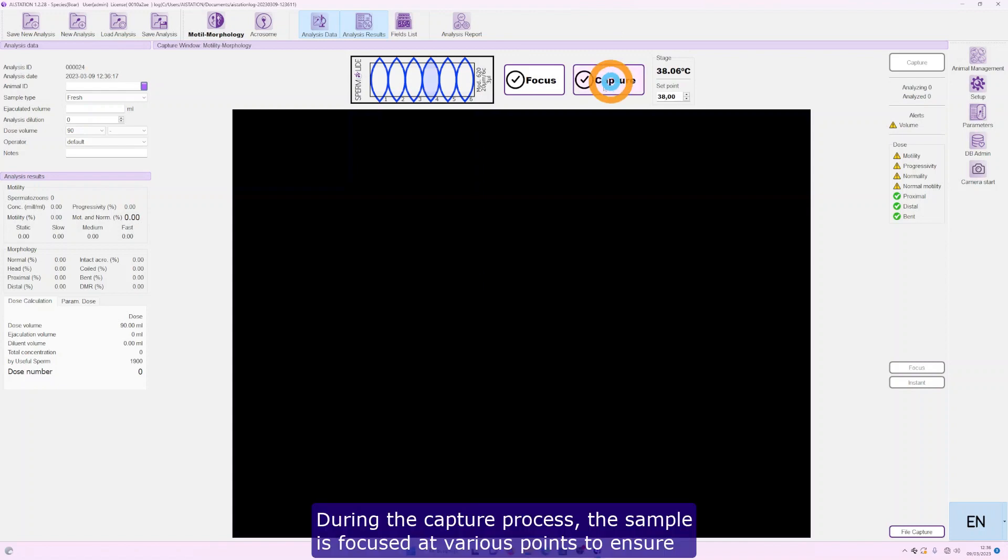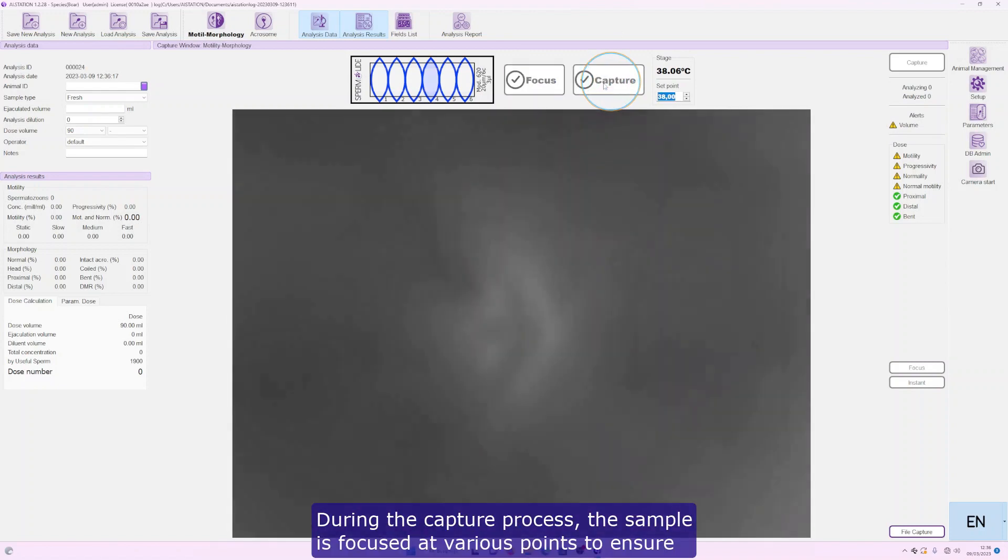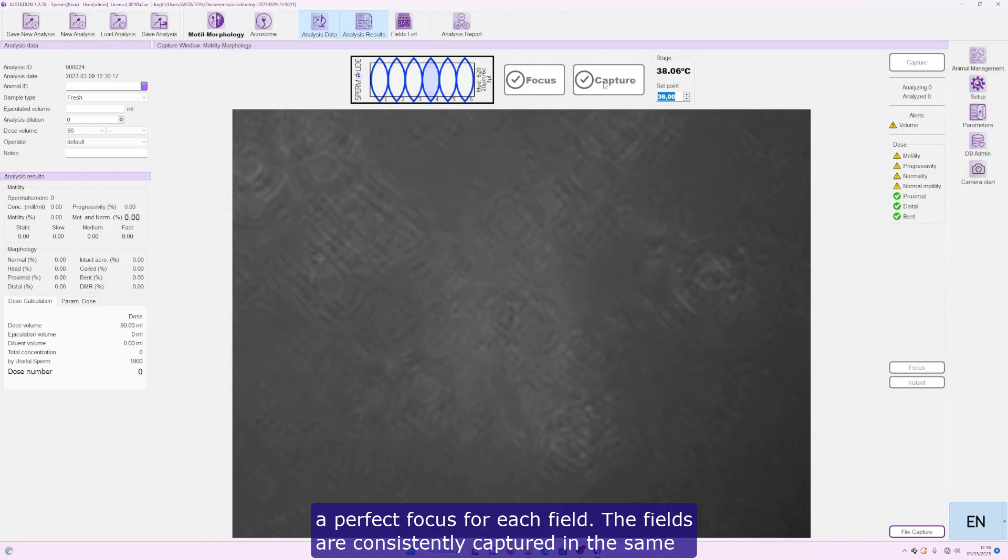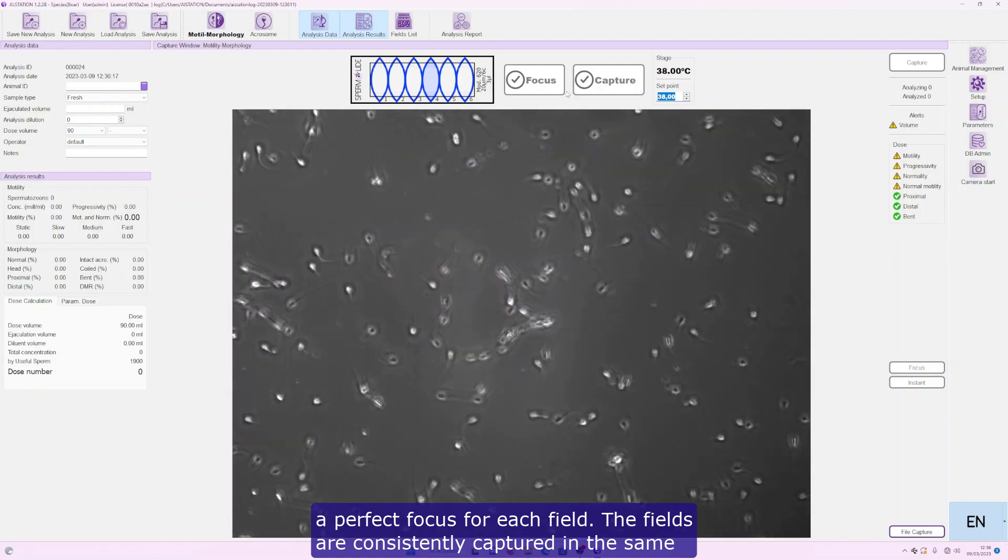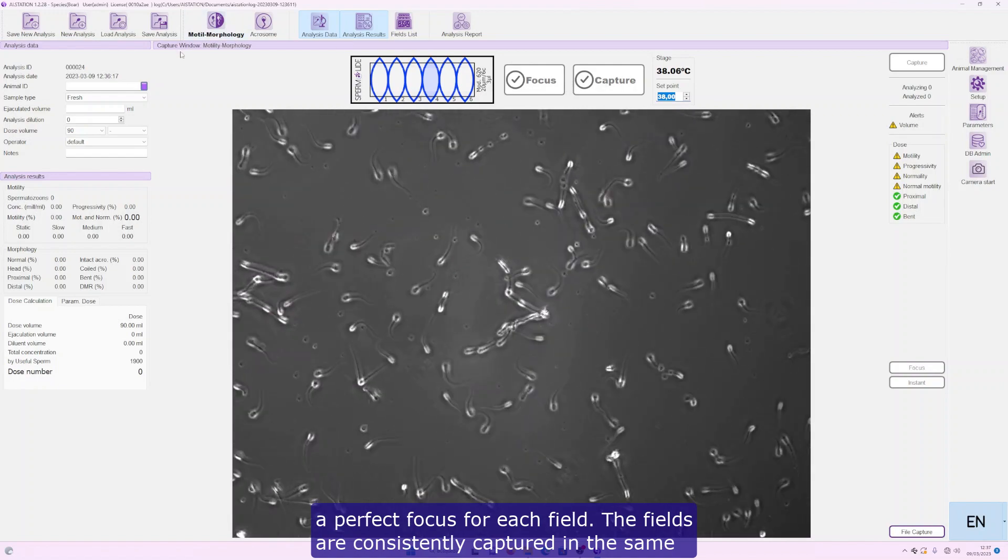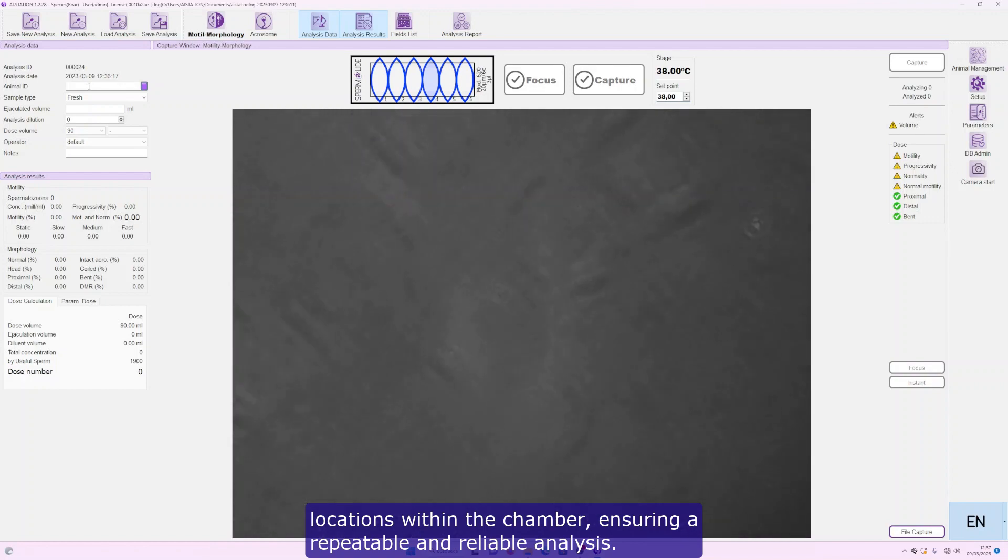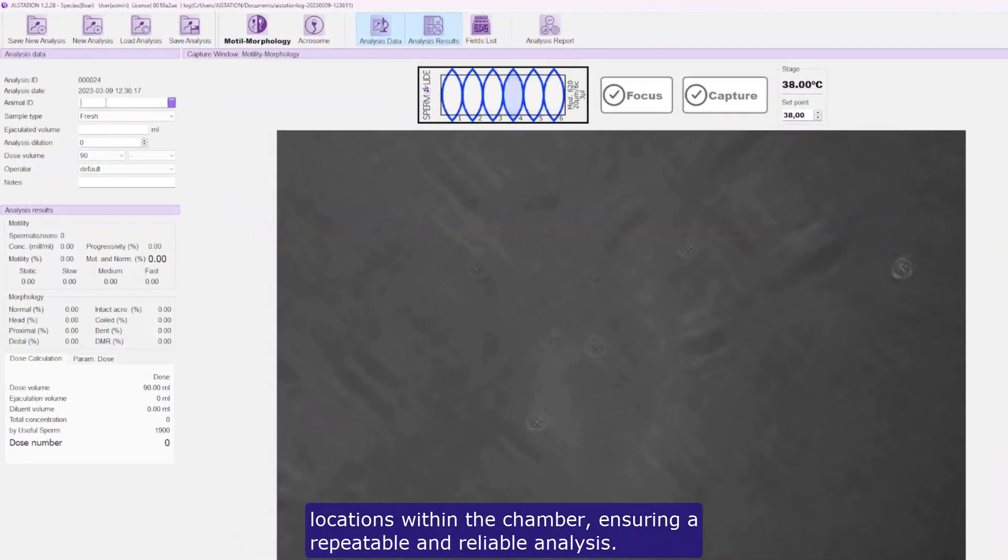During the capture process, the sample is focused at various points to ensure a perfect focus for each field. The fields are consistently captured in the same locations within the chamber, ensuring a repeatable and reliable analysis.